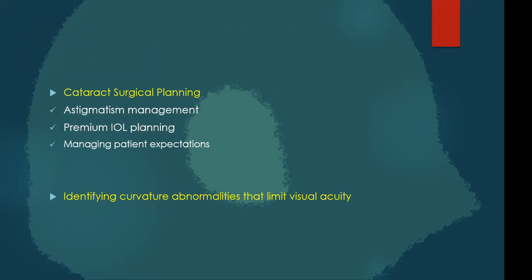It also helps us in surgical planning of cataract, because cataract surgery has become more of a refractive surgery these days. So it helps us in astigmatism management during cataract surgery. It helps us in the planning of premium intraocular lenses like the presbyopic IOLs, the toric IOLs. And it also helps us in managing patient expectations, because like I said, cataract surgery has become an extremely premium surgery and is almost like a refractive surgery.